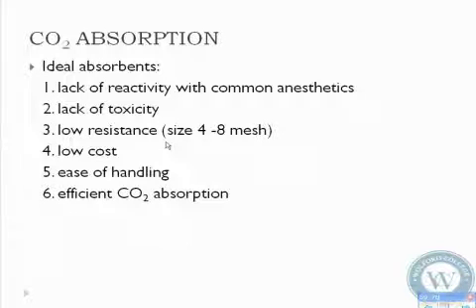Okay, then you pour it into the container. Anyway, we recently had those. I mean, we kind of got rid of all of those probably a year ago. All right, and they're very efficient to absorb CO2.